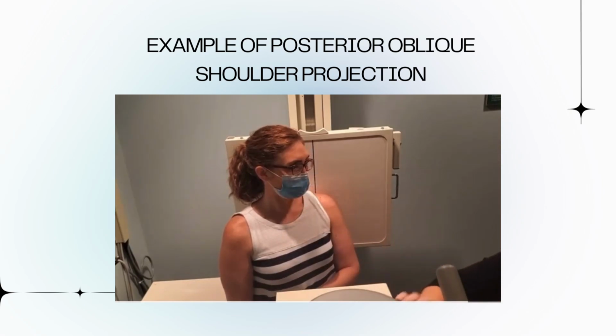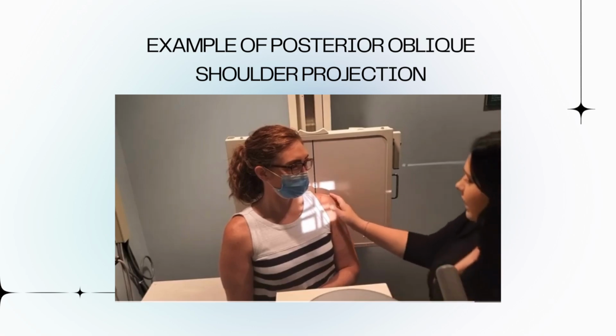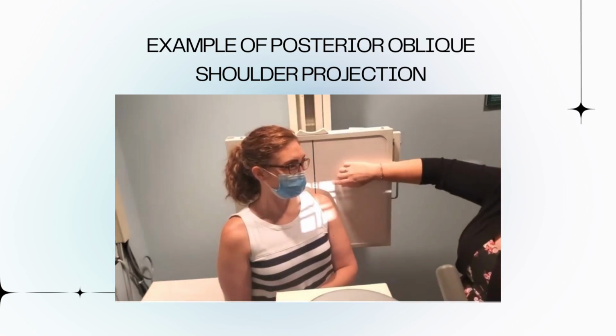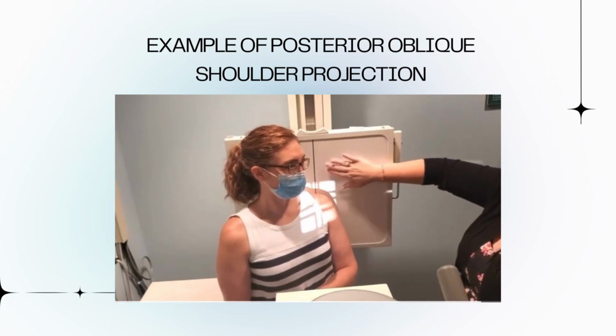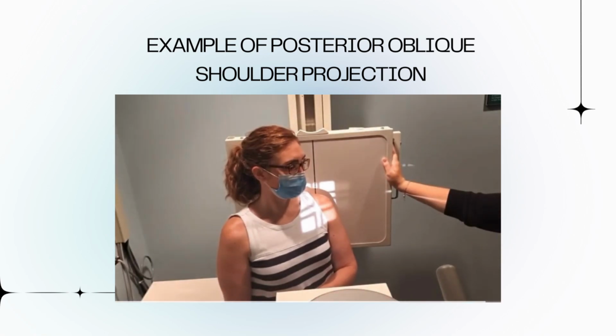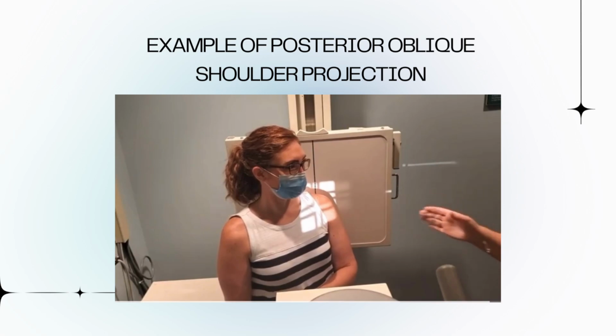And for this image, because you're only looking for that joint space, you can really collimate in tightly to just that edge of the humeral head and the surrounding joint space, and I would put a marker right in this light space, the left marker, because the left side's down and that's the side of interest, okay? This is still a 10 by 12 inch cassette, and again, 35 to 45 degrees rotation. It's going to be very patient to patient, but just try that thumbnail trick and that can help you get a gauge of where you're going to want to center and direct your patient.